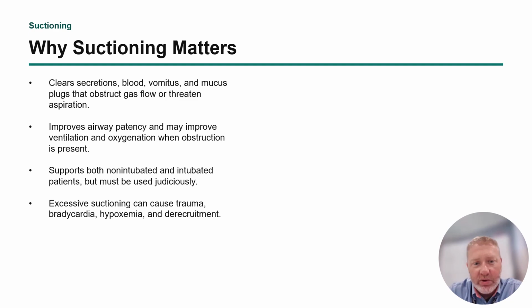Suctioning en route, very important. Man, I remember neonatal transports, some peds transports where the secretions were just everywhere, and we spent the whole time just trying to manage their secretions, and couldn't really do anything else, like with their ventilation or their oxygenation, because we were spending all effort on just keeping the airway clean. When you do that, other things kind of follow suit.